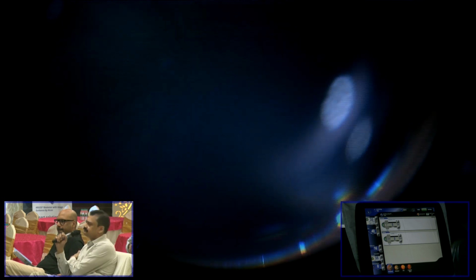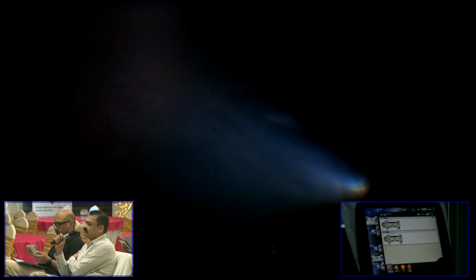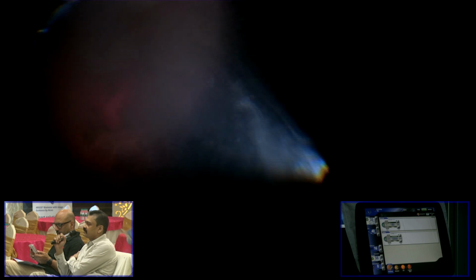But what will be the harm if we pull it? You think there will be bleeding from the disc? Yeah, it is possible, but since it is a Terson Syndrome VH, and in Terson Syndrome usually the peripapillary capillaries bleed, the disc and disc vessels usually remain normal. So there is no harm in pulling that, but I don't think there is any additional advantage of pulling that. So if it is not advantageous, then better we will not insult the tissue. Okay.